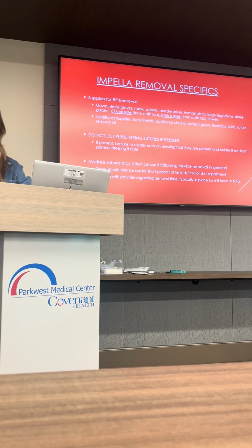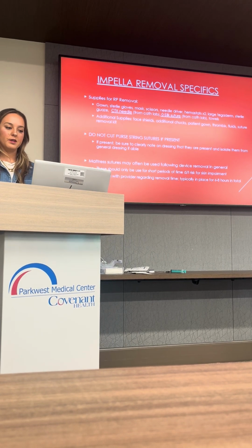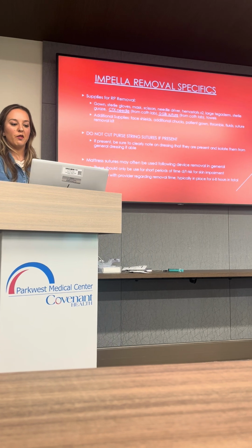There's oftentimes some things in there that you may need, and there's other providers who may not use the same devices as what I've mentioned, so a suture removal kit may come in handy.